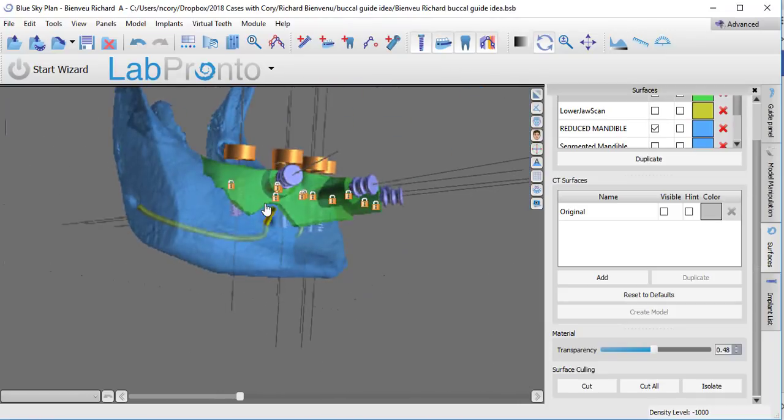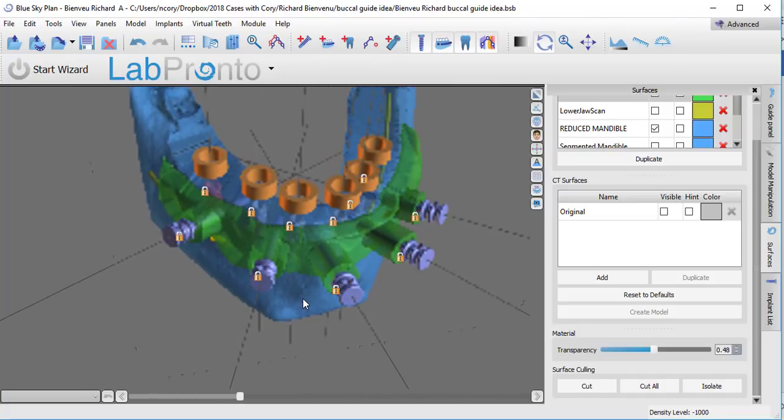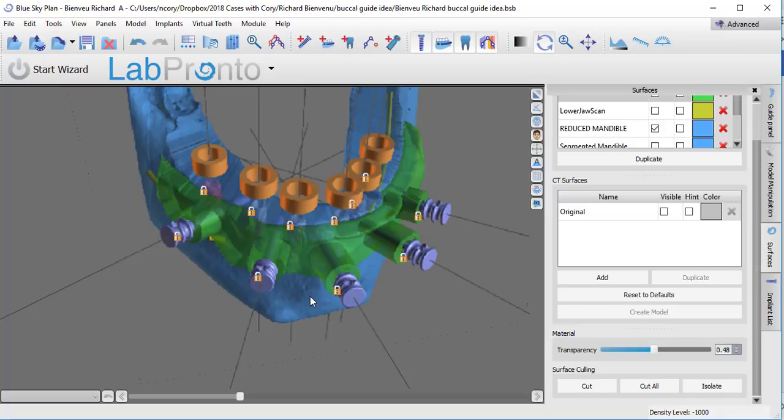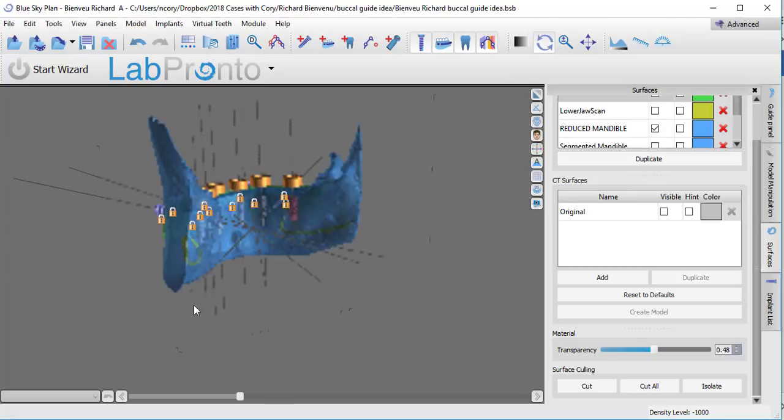Okay, and if you feel like this is over contoured, remember this is just printed resin, so you can just grind on this, do whatever you want. The resin I feel like is going to be the most cost effective. There's no reason you can't print this in metal if you so choose, but it can be pretty pricey to do that. The advantage in metal is that you can keep it much more thin. So when I do it in metal, I'm usually going down to a thickness of about 1.5 millimeters. So the access really is nice with those. But it's personal preference, up to you what you want to do from here.